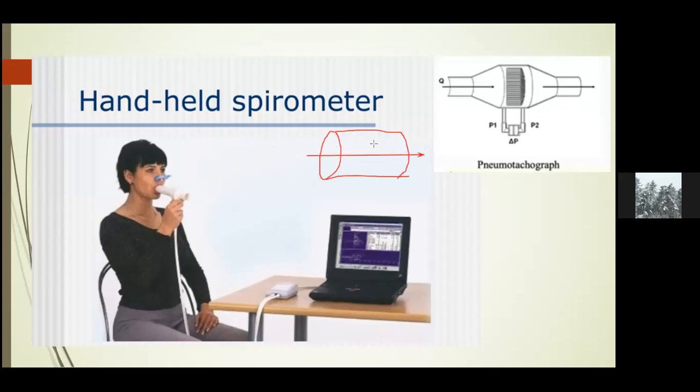What you can do is, using a time component, allow air to move and capture, say, for 1 second, how much air has moved. So you have the component of flow, which is usually volume per given time. So volume displaced or moved per given time describes flow.